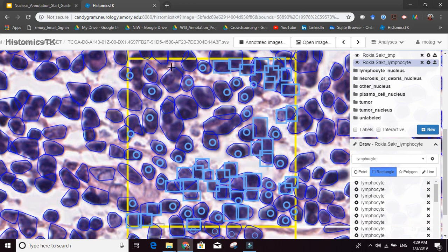And then you can see there's 3 of them here, so let's do this. 1, 2, 3. There's one here. There's one here. And there's one here. Okay. These are 2 lymphocytes that the computer kind of thinks are 1, so let's do those. Let's break up this cluster here, so let's do it.